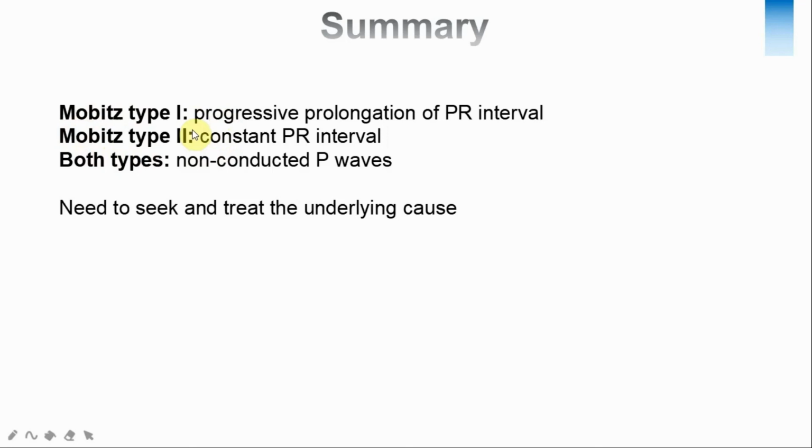Hope that helps. We have a huge collection of second-degree heart block ECGs that we will show you in the subsequent videos. Watch the space. Absolutely. So we'll have some case-based discussion, and I've got almost 100 ECGs of both Mobitz type 1 and Mobitz type 2. Not many Mobitz type 2, but quite a few Mobitz type 1. So we can discuss them in the subsequent videos.